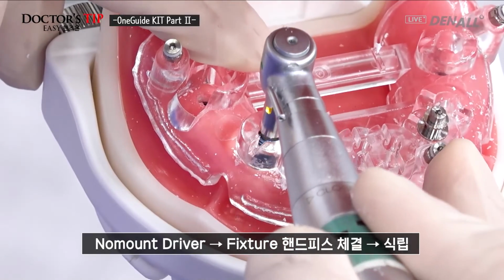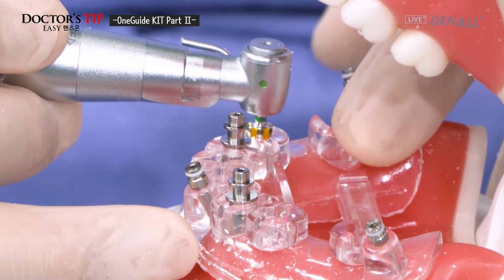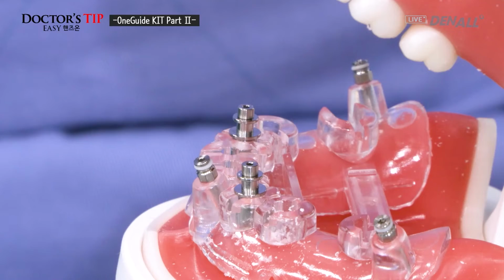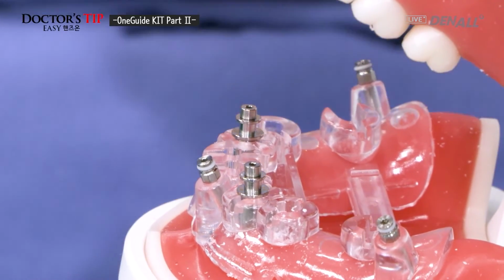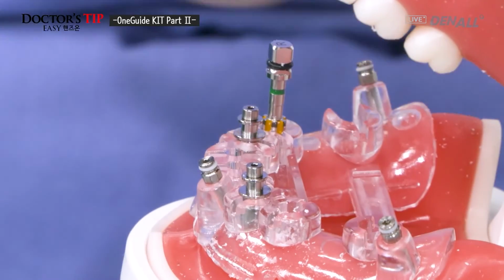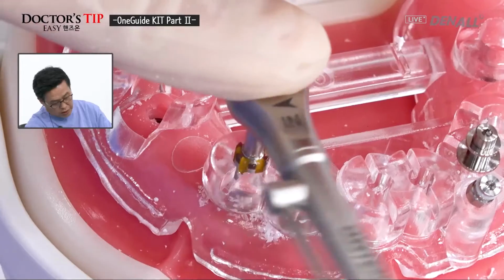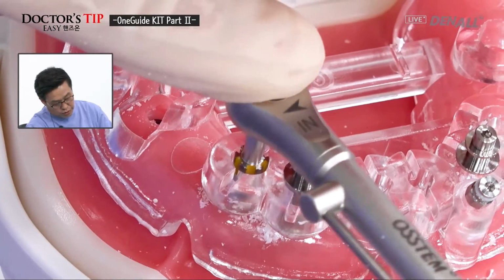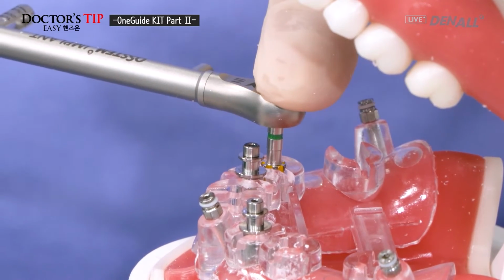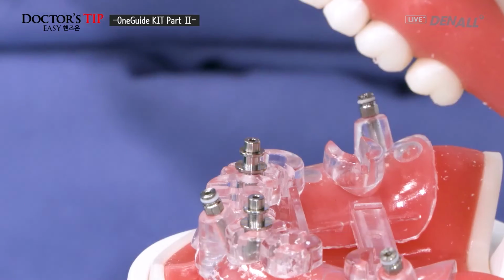And on number 44, implant is going to be connected. Approximately 80%. Put the fixture. And then, if you look, fixture driver regular size is chosen. And connected fully using hand wrench. Final depth control and hex control is going to be done. As you can see, align with yellow. So hex is controlled and final torque is 30 Newton centimeters.